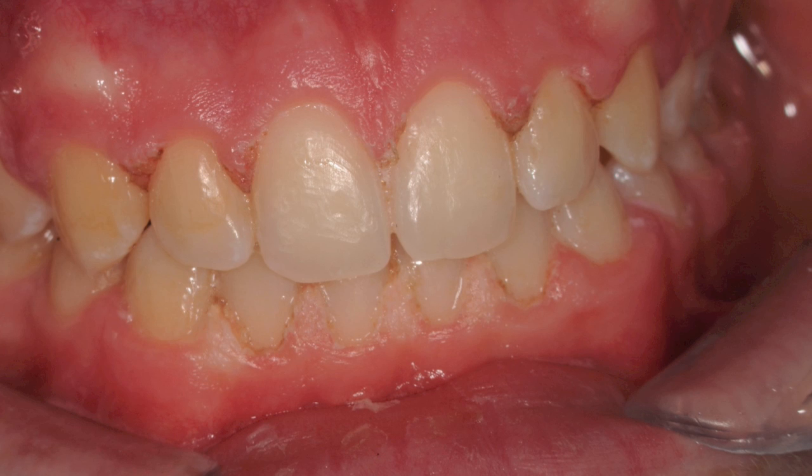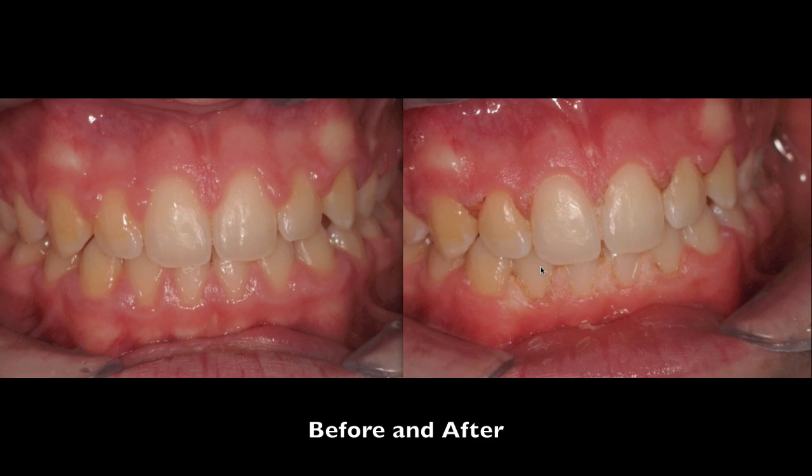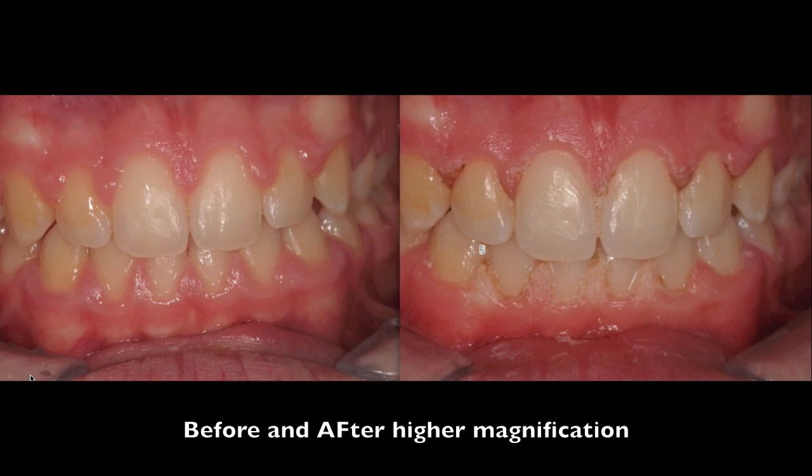You can see before and after at low mag, concentrating on the laterals. At higher mag you can see how we've been able to significantly improve the overall appearance.